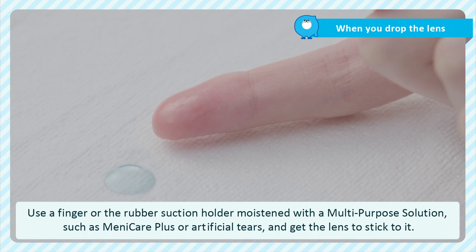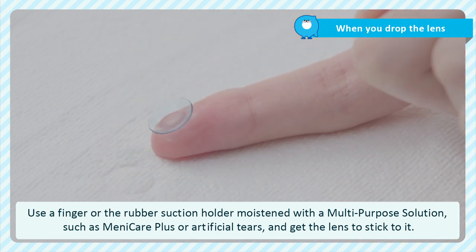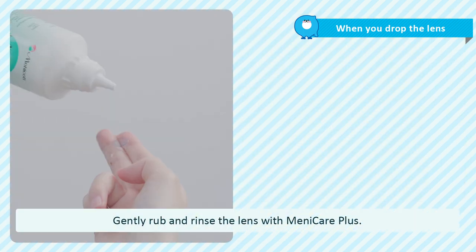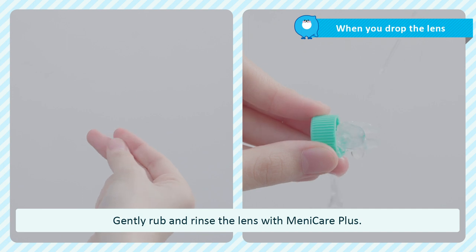If you drop the lens, use your finger or the rubber suction holder, moistened with a multi-purpose solution such as ManyCare Plus or artificial tears, and gently get the lens to stick to it. Make sure to clean and rinse with ManyCare Plus before wearing them again.